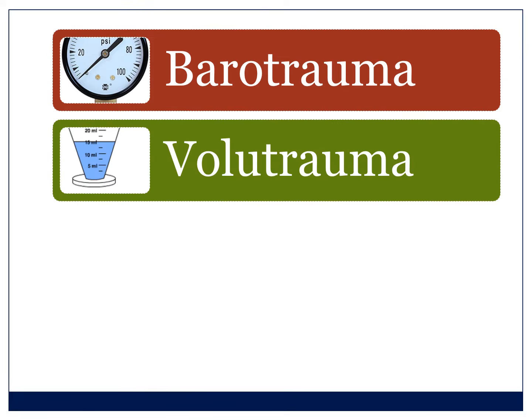Whenever you set a ventilator, there are 4 types of trauma you must consider every single time you set the ventilator. The first is barotrauma. That's the one everyone remembers. It's pressure trauma. So if you have too much pressure, you damage lungs. That makes sense. So we need to think, how is our ventilation causing pressure, and what is the difference in pressure between the highest pressure and the lowest, which is called your delta P.